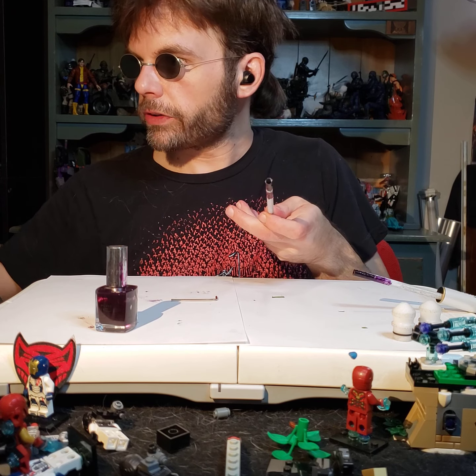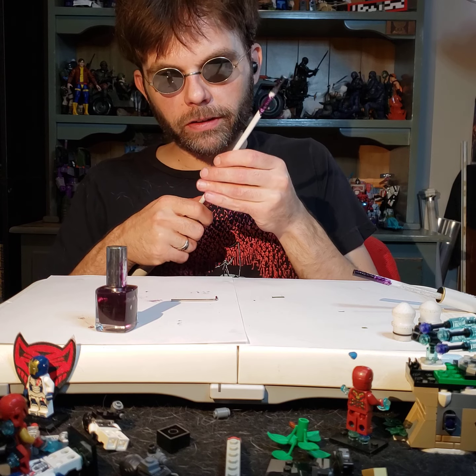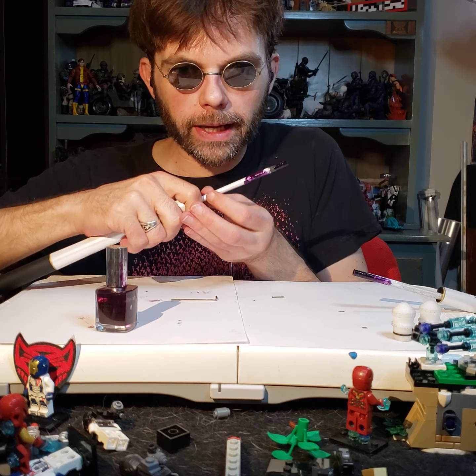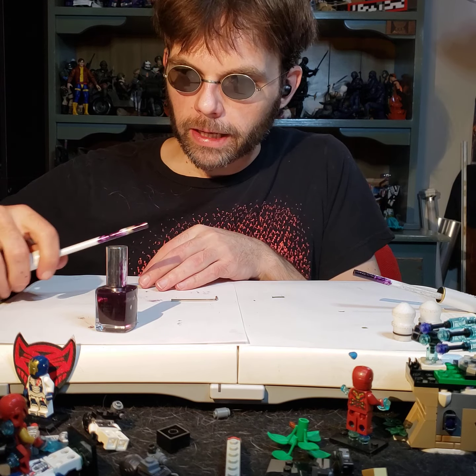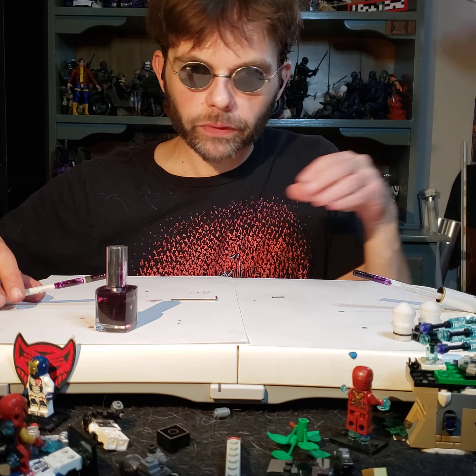All right, where did I put the cane? Okay, so here's the cane that we just finished making the tip, painting the tip for. We're going to slide it in the reverse way, and we're going to set it over here so that the end of it sits out in the open and can air dry.